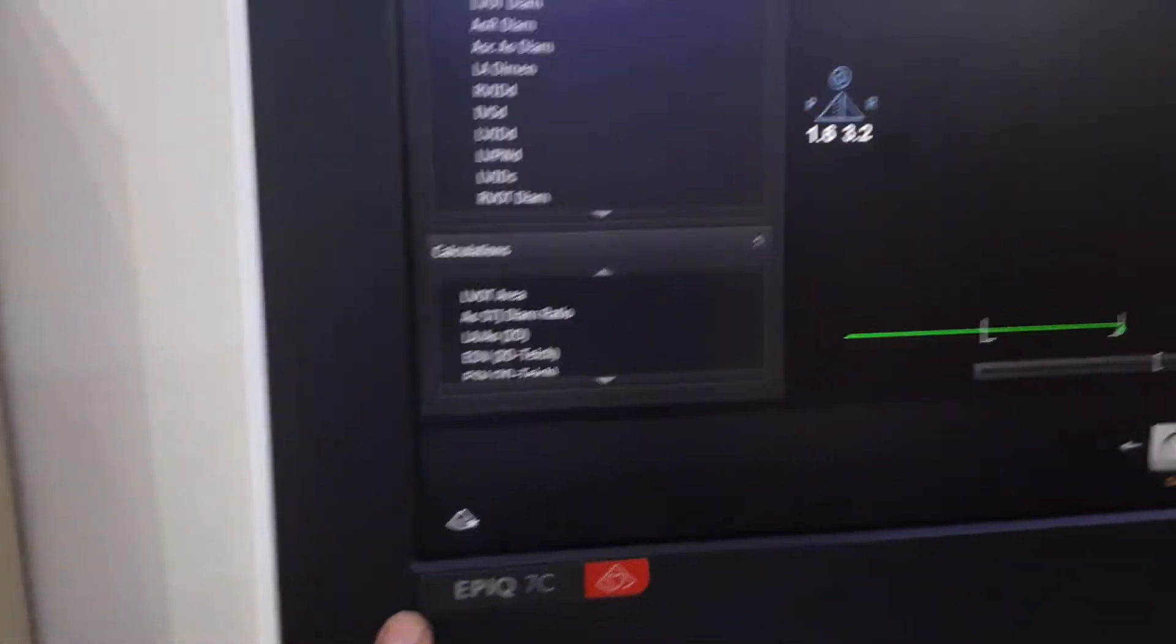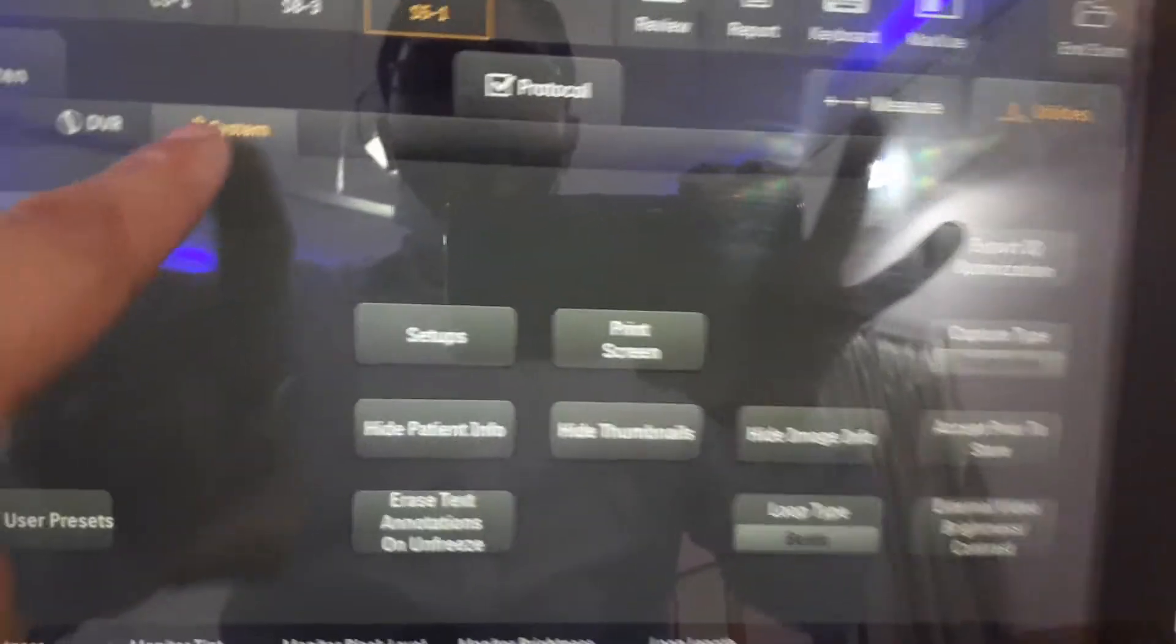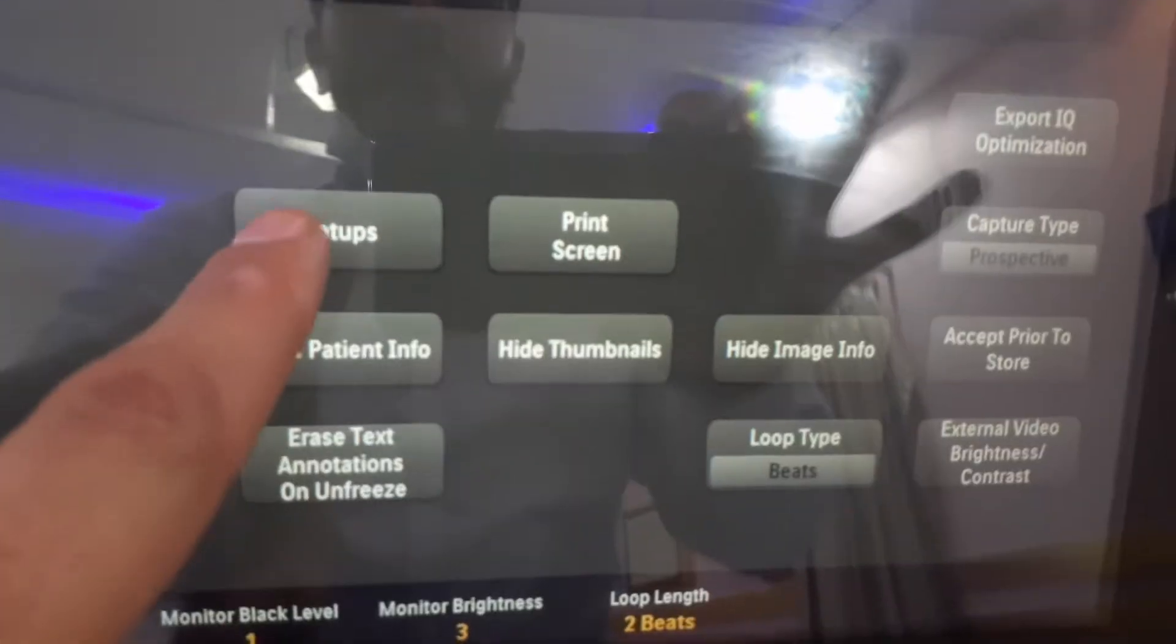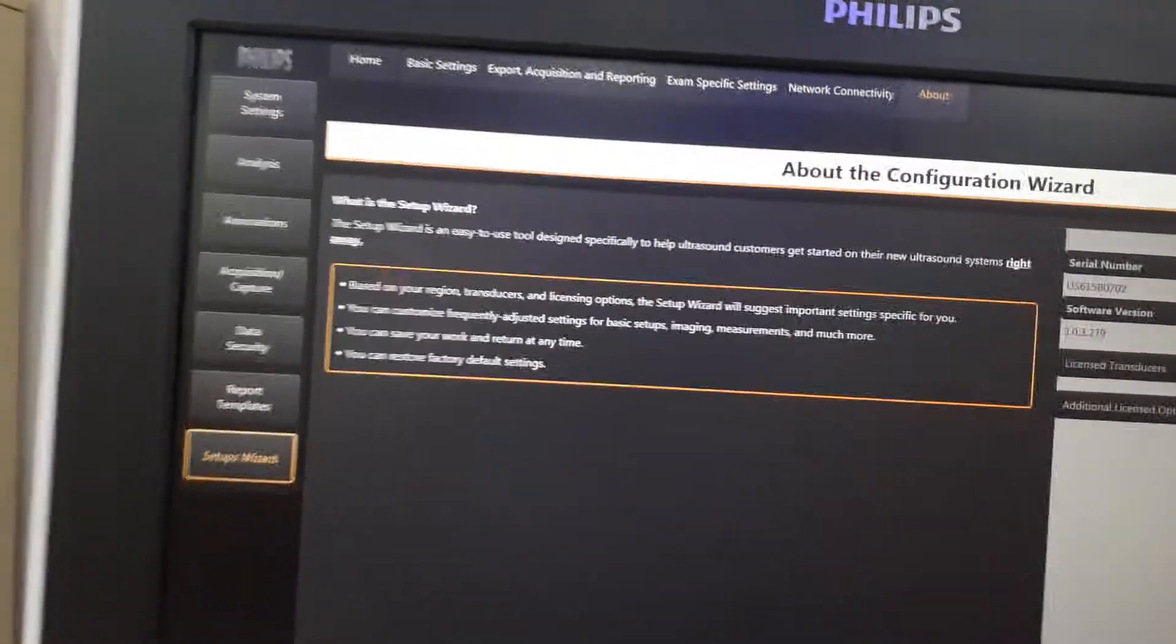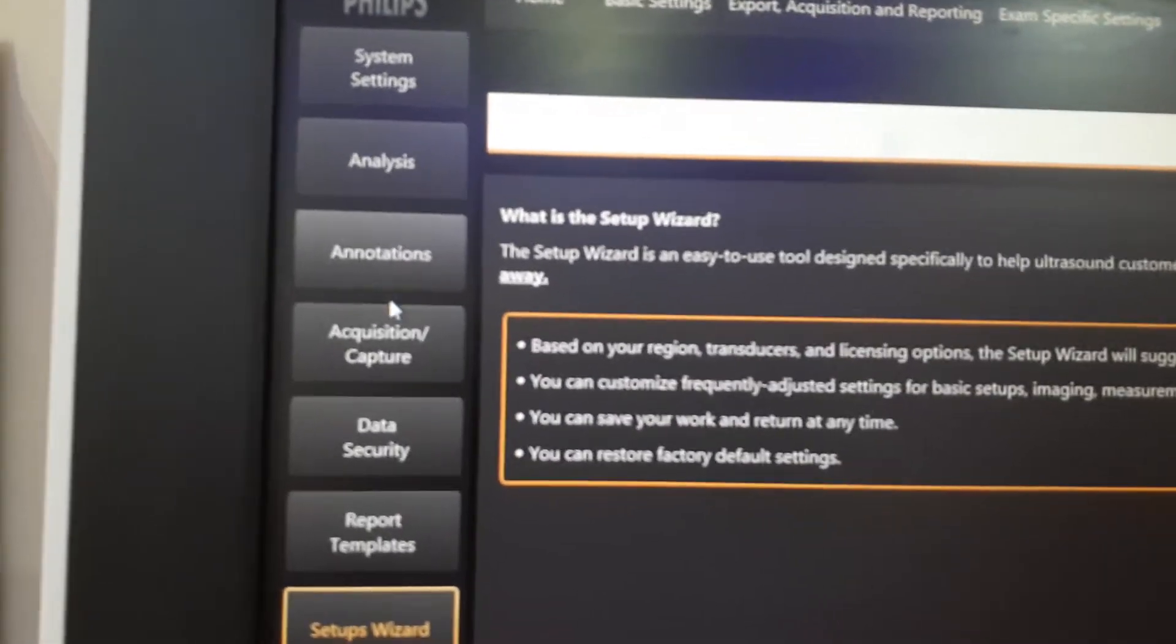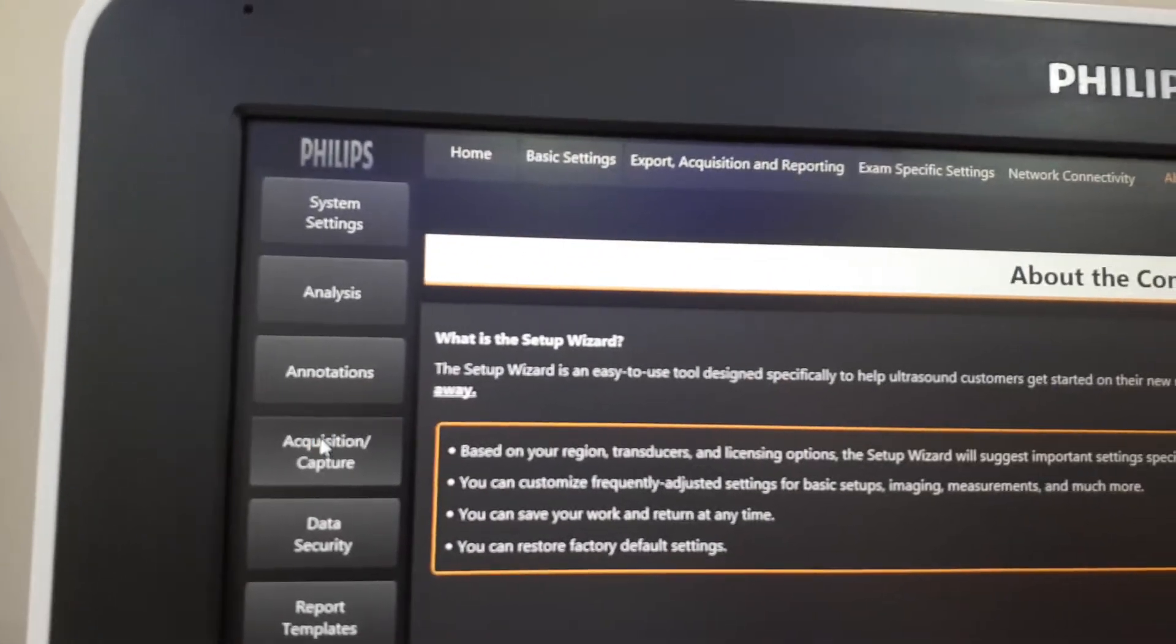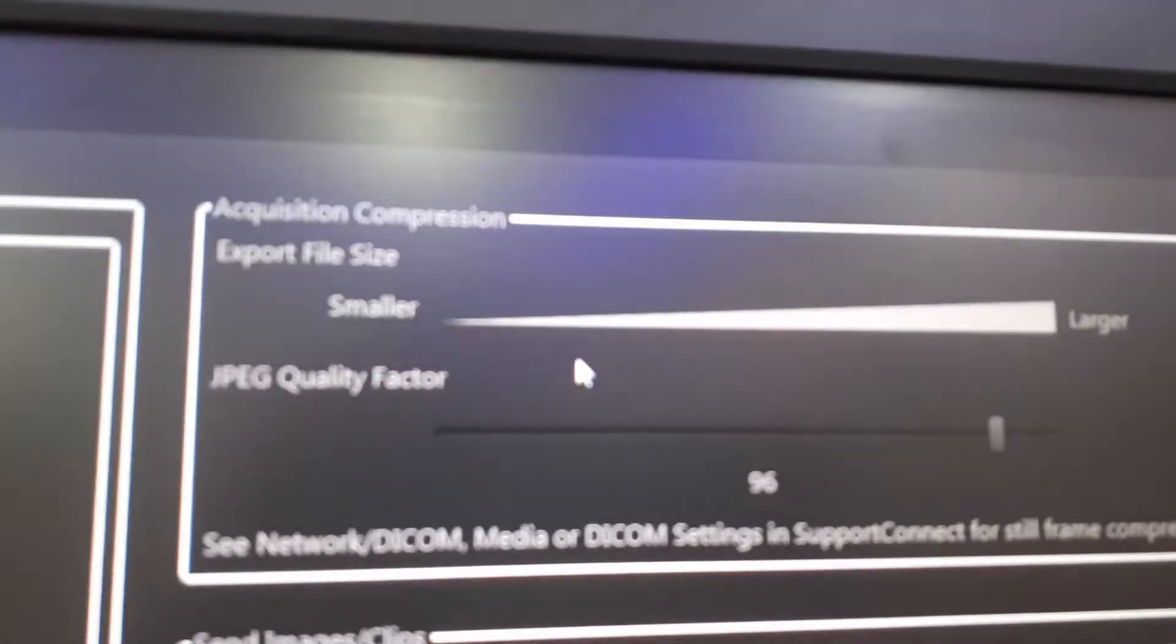First, on the touchscreen we go to Utilities, then we go to System, then we go to Setups, and we go to Acquisition. Here we'll see the export file size for JPEG quality factor.